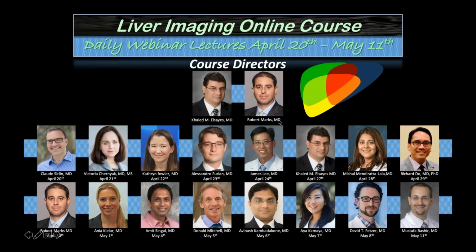We have a question from Dr. Pradnya Mahitar from India, I think. Pradnya? Hello. Hi, Dr. Kielar. It was excellent cases. It's not really a question. It was just a comment on the first question where we're trying to figure out if things are iso-intense on portovenous phase imaging or they are washout.